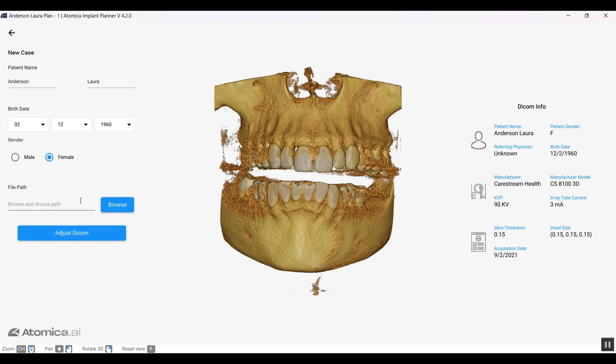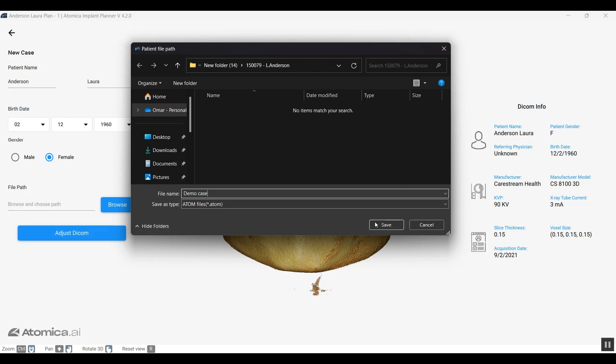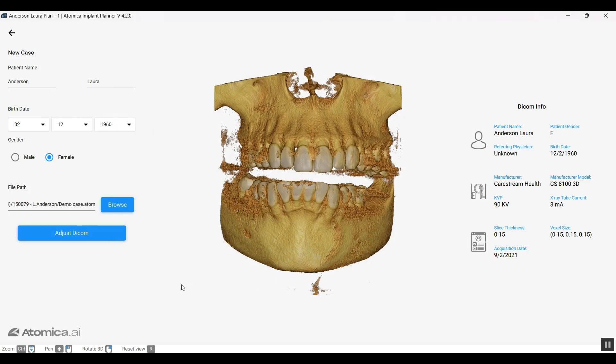The very first step before planning is we need to browse and choose a file path where we're going to save our planning file. Let's name that demo case. It's saved under our format which we call Atom. Let's save that to save the file and move forward to the next step.